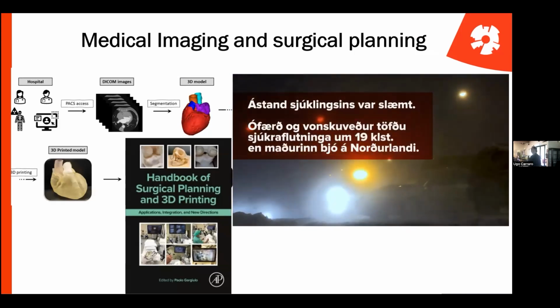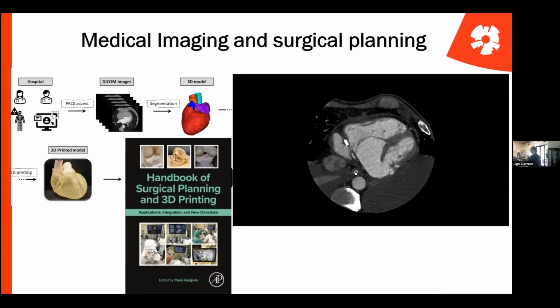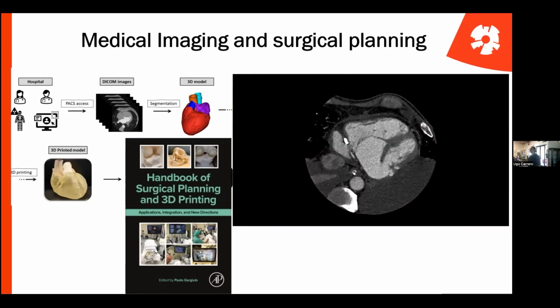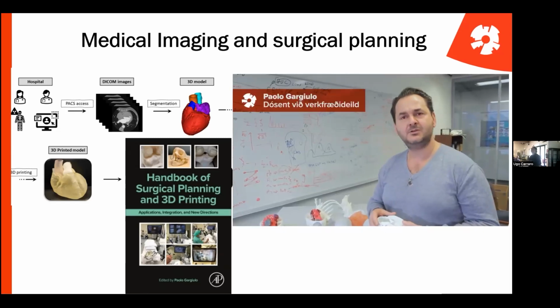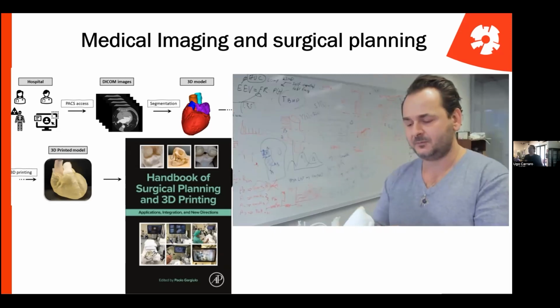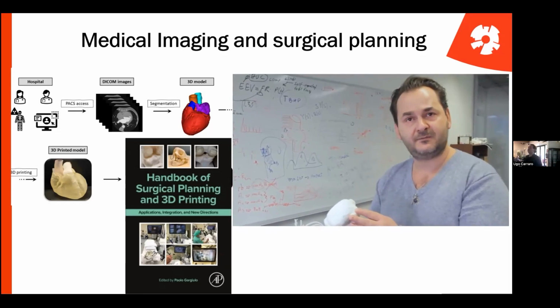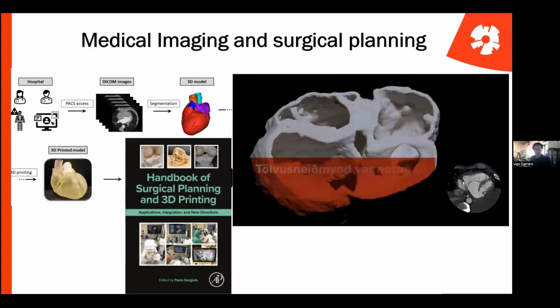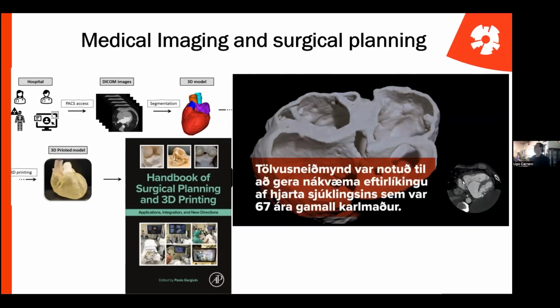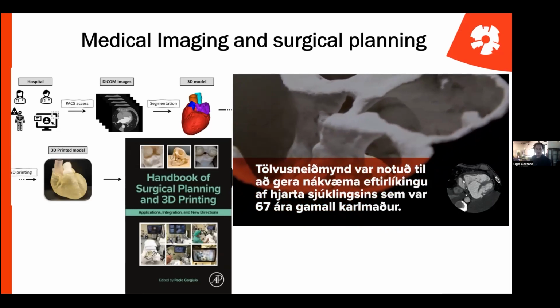So still today, and actually for 10 years, it's possible to order 3D models through the web portal of the hospital. And this is completely automatized. And today we have a very nice infrastructure that can make this very convenient for the surgeon and very accessible. So this is a very important direction that the imaging took in our research line.